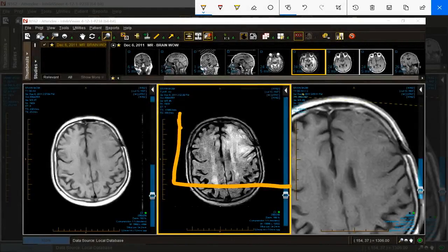Taurine. We alluded to taurine as an underrecognized, underutilized, but important spectroscopy peak at 3.25, 3.43 parts per million, just to the left. So if I draw out my spectroscopy scale like this, we said, okay, I've got a lactate lipid peak over here, and I've got a choline peak over here. So this would be 3.2 parts per million. This would be 1.33 parts per million. So taurine is going to be just to the left of the choline peak. So let's call that taurine.